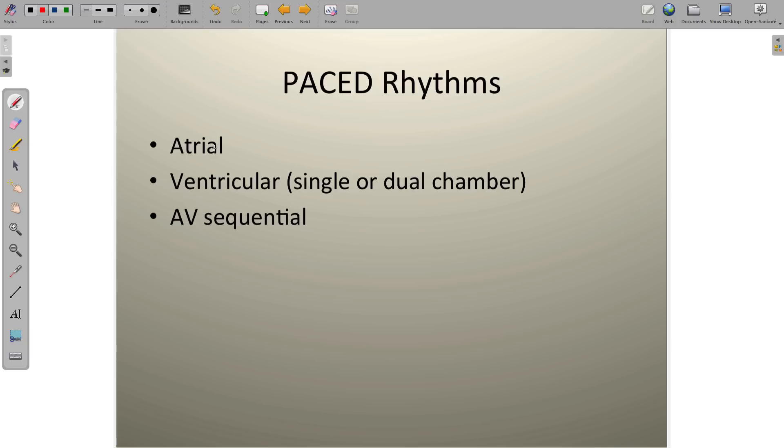The three pacemakers we're going to look at are atrial pacemakers, ventricular pacemakers — and sometimes we'll have it in just one chamber or it may be in both ventricles, with both a right and left ventricular device causing stimulation — and last but not least, the AV or atrioventricular sequential pacemaker. These fire at the atrial and ventricular level because the SA node isn't working and the AV node isn't working, so we have to separately fire the ventricles.